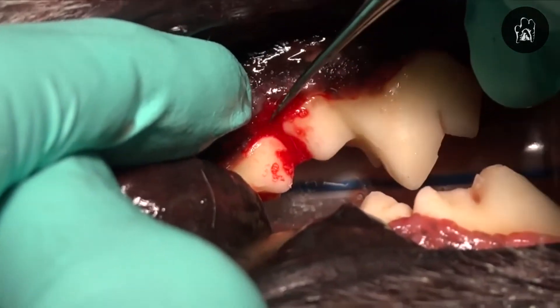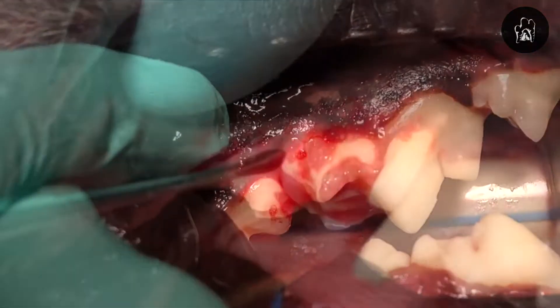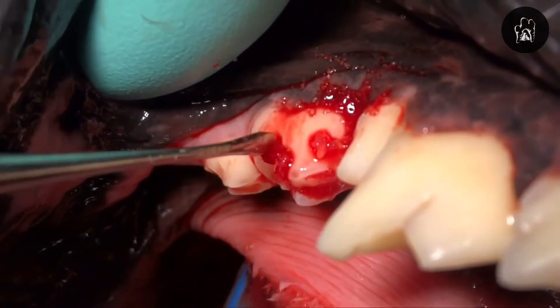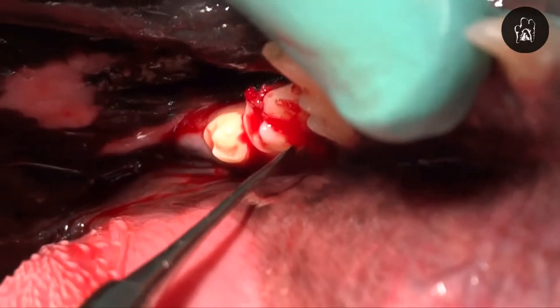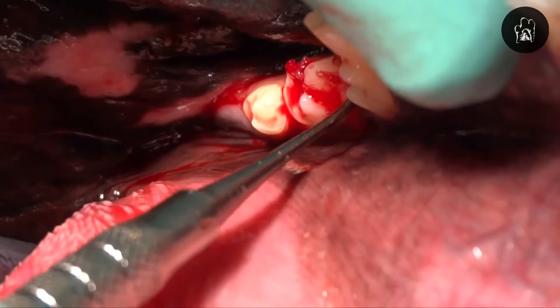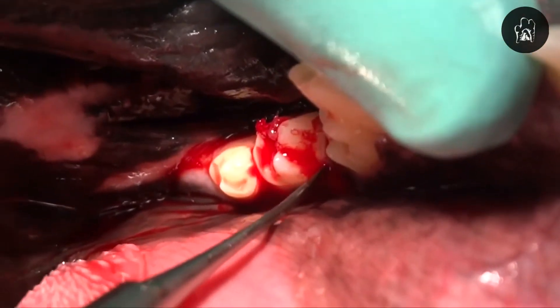That's pointing to some of the granulation tissue that we got out of the defect, as you can see there. And we're using that periosteal elevator to pack that bone graft down in on the lingual side to make sure we've got good fill.